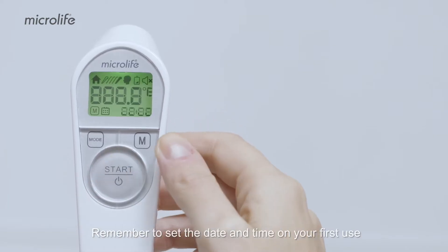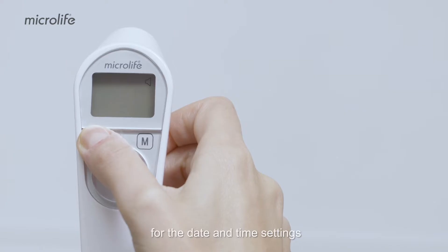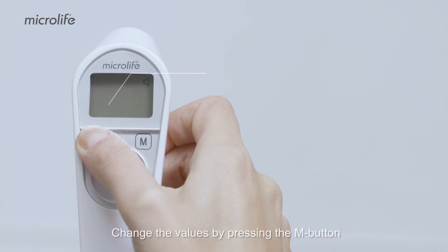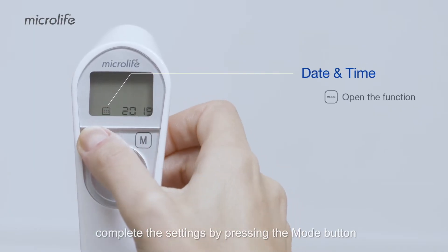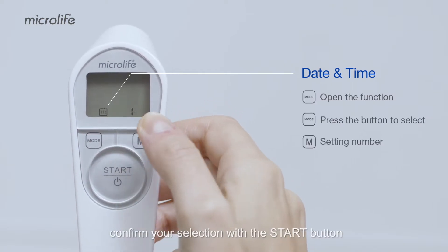Remember to set the date and time on your first use. Press and hold the mode button for the date and time settings. Change the values by pressing the M button and complete the settings by pressing the mode button. Finally, confirm your selection with the start button.